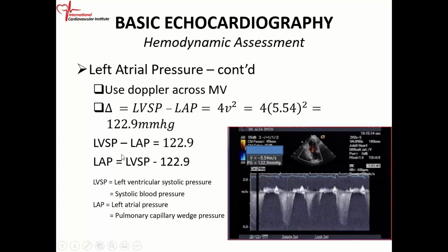As we said before, the LV systolic pressure is the same thing as the systolic blood pressure, as long as there is no obstruction across the LVOT. And you can calculate that left atrial pressure. Okay.